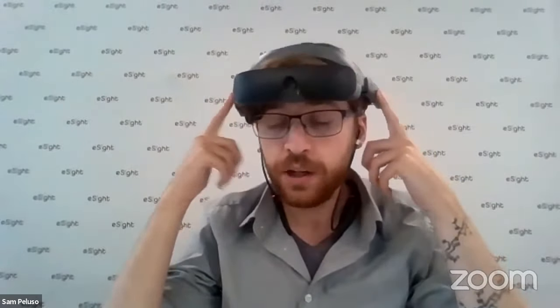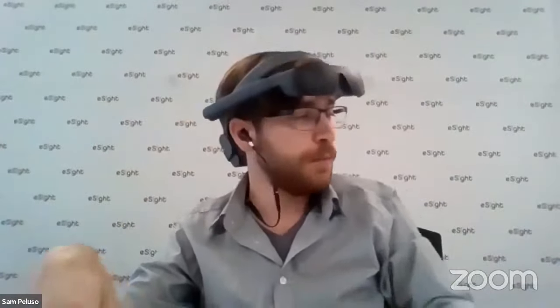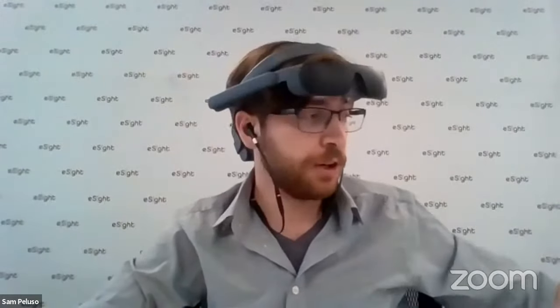You can also send any photos that you've taken with this. You can use the app to send the photos on the device to your phone. Oh, nice. You could also send photos that you've taken on your phone to the device in case you want to look at those there. And one of the most fun things that you can do with it is mirror your phone screen on the eSight. Awesome.